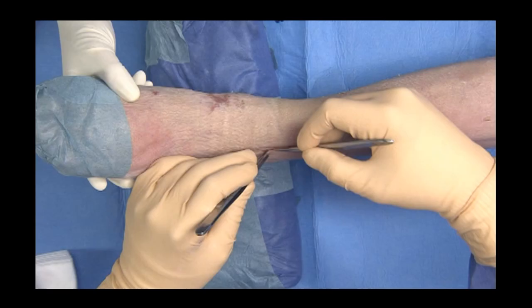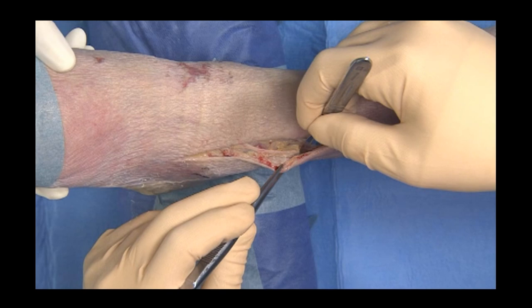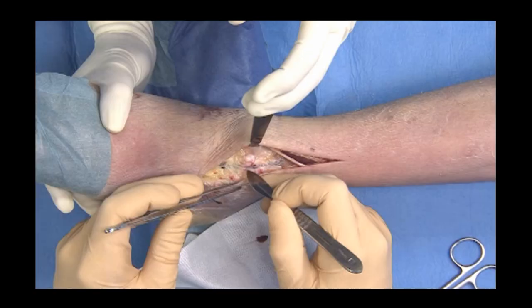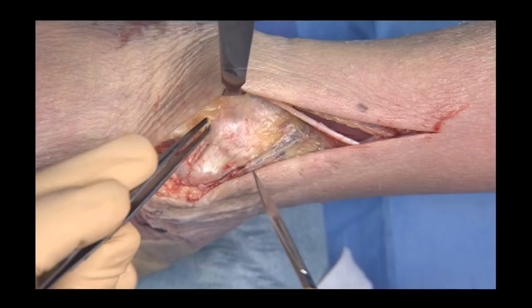The superficial peroneal nerve lies directly beneath the skin and crosses the surgical approach at ankle level. The proximal part of the incision is identified, mobilized, and retracted medially. In the anterior compartment, the tendons are retracted in order to access the ankle joint.